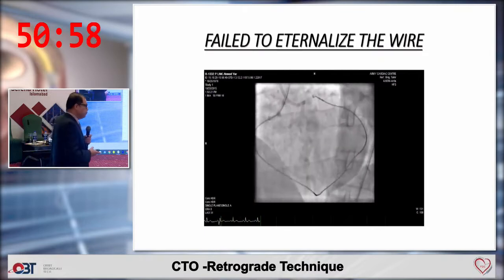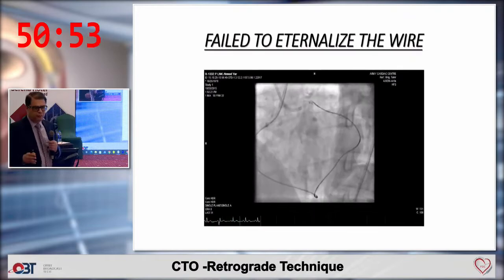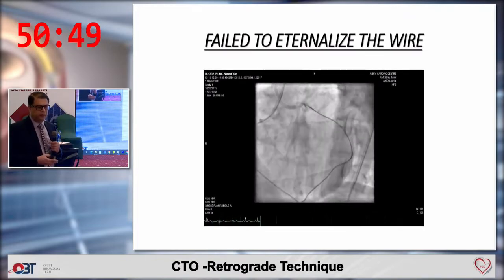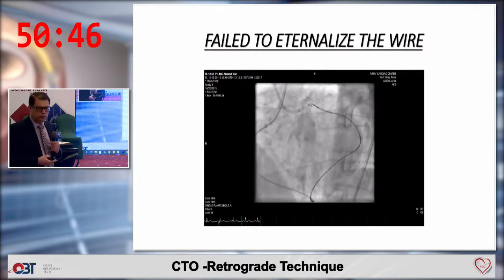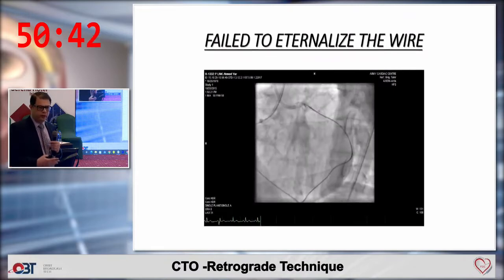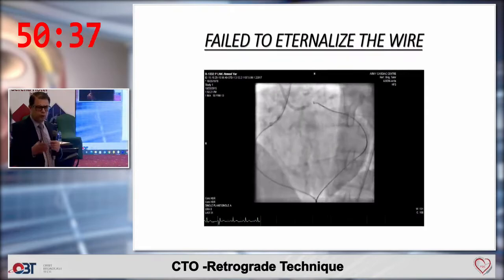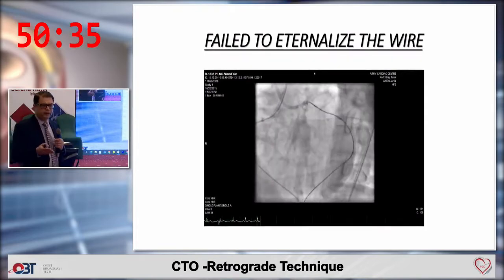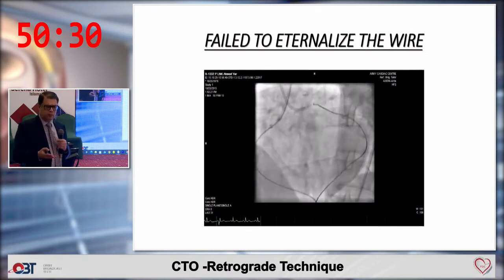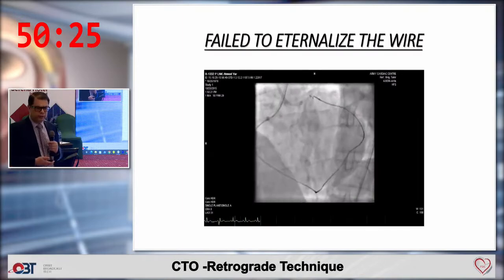That's a very good question. Actually, I was not doing the antigrade case. I was called once the antigrade operators had failed, and they asked whether a retrograde approach was possible. So I was brought in at the stage in which they had started the retrograde. Probably they tried different wires and the wire went subintimal. Although you are right, we could have tried many other things like the parallel wire technique or different wires, which I am sure they must have tried before calling me to do the retrograde.